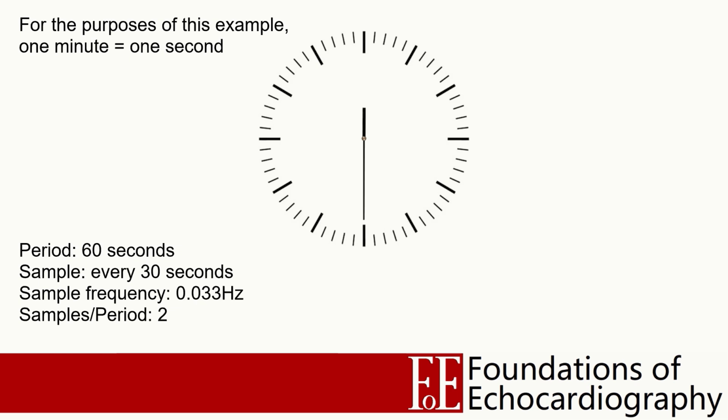We can be certain the second hand is moving, and as we can see that it always points straight up every 60 seconds, we can imagine that it's rotating once per minute. But we can't be certain whether it's rotating clockwise or anti-clockwise. If we glance at the clock every 35 seconds, we're now sampling with a frequency of less than twice per period.